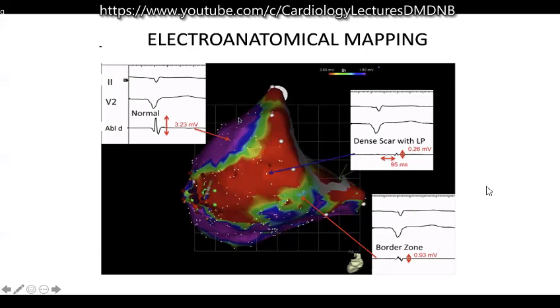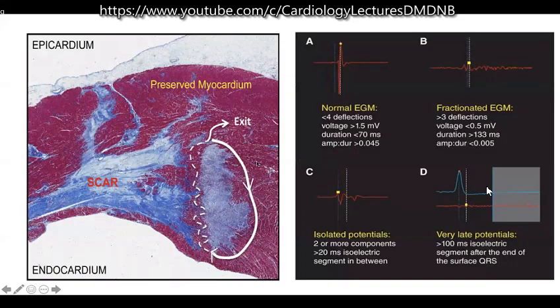And I also define the normal zone, that is when the voltage is more than 1.5. So this is the total voltage where my cursor is moving. In between, the area where there are shades between the red and the purple is a semi-infarct zone. These I call borderline zone. So once I identify both these zones and the abnormal signals, my task relatively becomes easy.